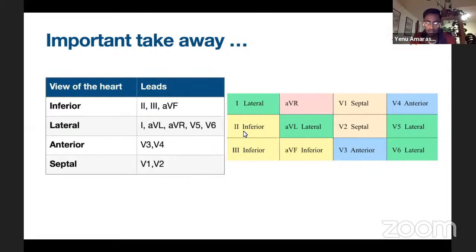It's something that I didn't realize was important until a couple of years ago. So if I was you guys, I'd try to understand and maybe memorize what each lead means. It'll help you out, and it's much easier to understand when there's, for example, a myocardial infarction.